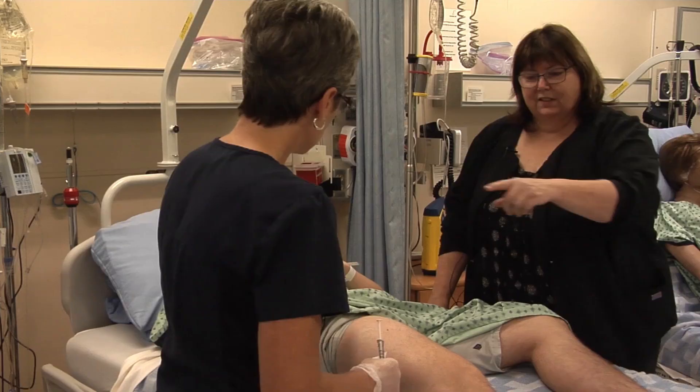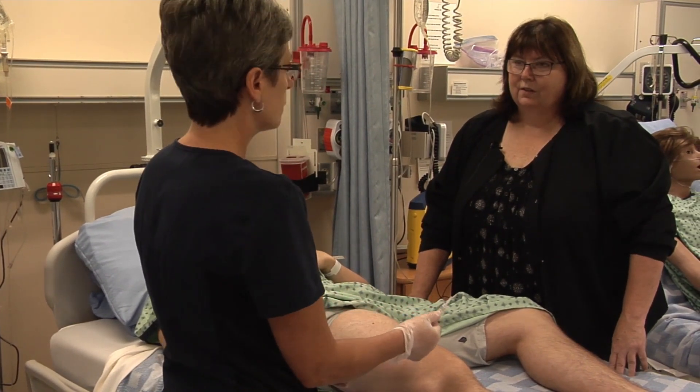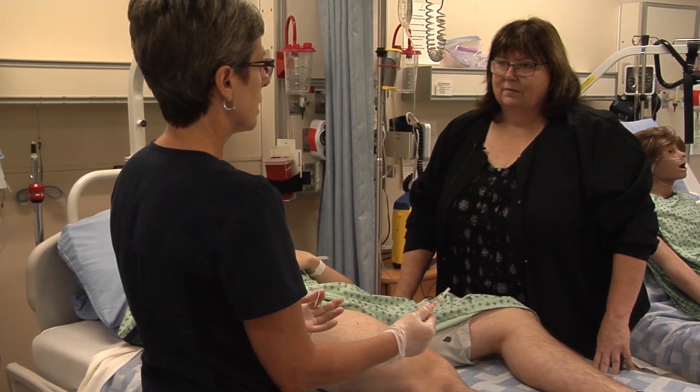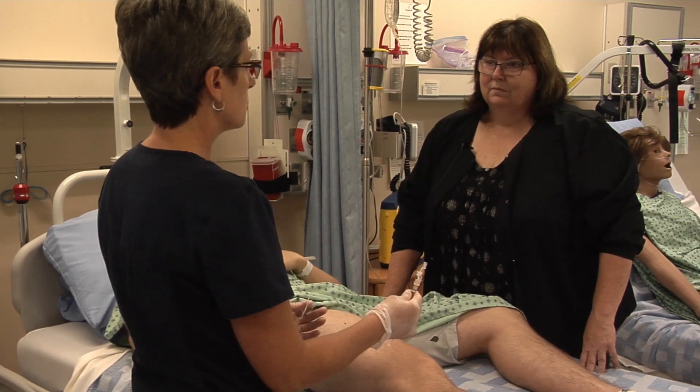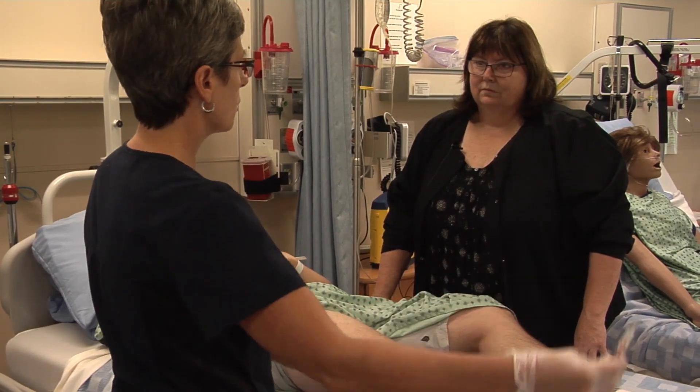So I've left the site. I see you've engaged your safety there. Never, never, never recap a needle. And if in a situation you absolutely have to, it has to be that scoop cap. But engage your needle and then dispose of the whole thing into the sharps.